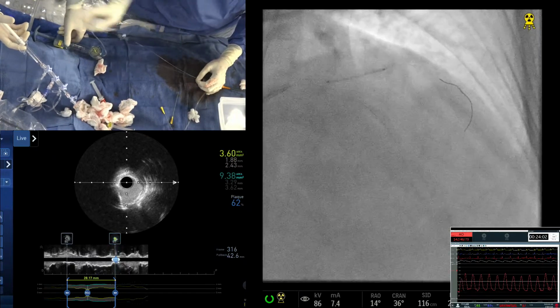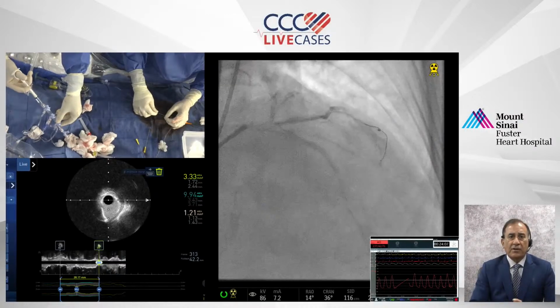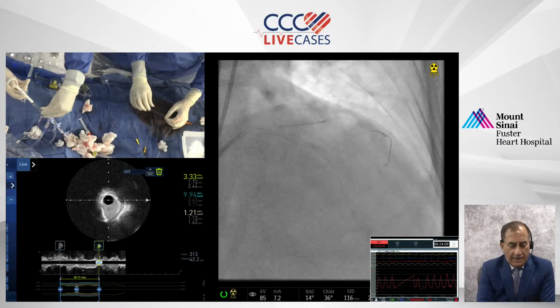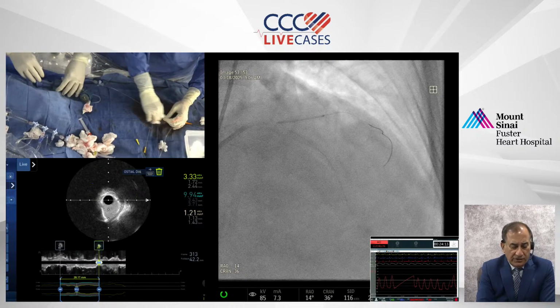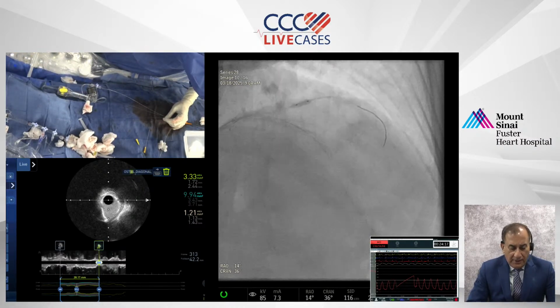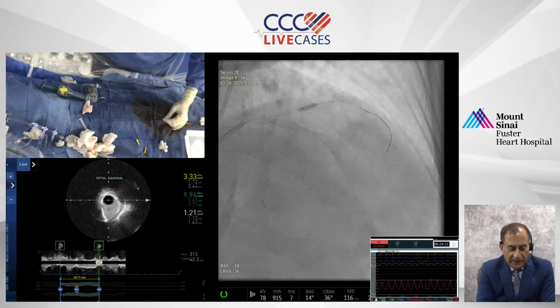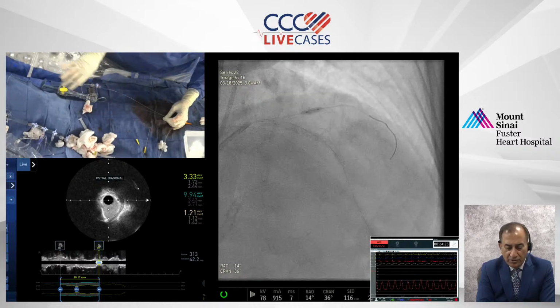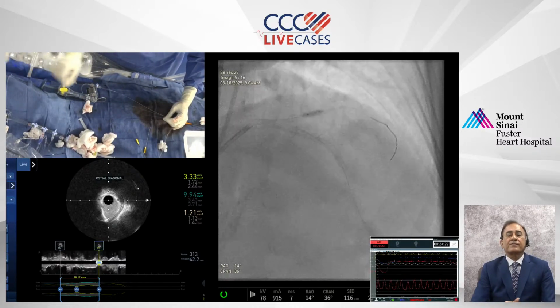Okay, Samim, there is a useful question which has come in. I think it'll help a lot of our viewers. Good. Okay, give me 23. What is the question? The question is from Dr. Savan Jainpurkar. I used IVL in an angulated, calcified lesion, and the balloon ruptured, then got stuck, unable to retrieve the balloon even after trying all techniques. Yep.